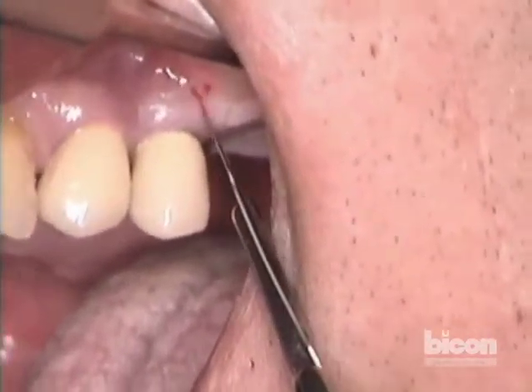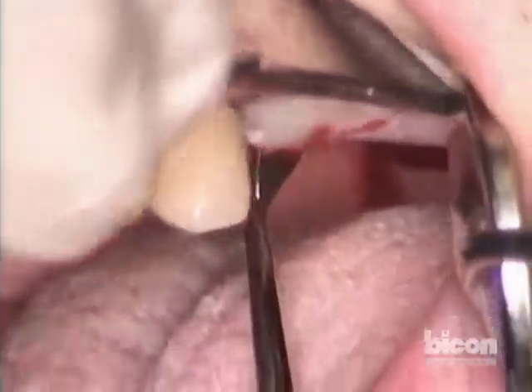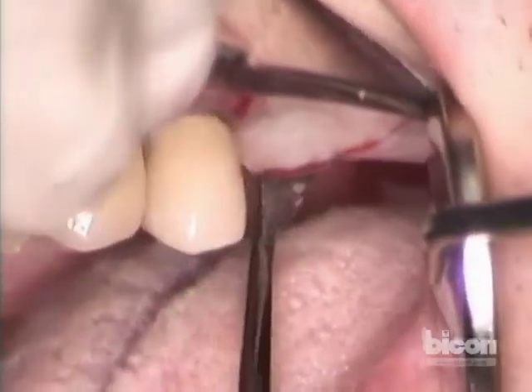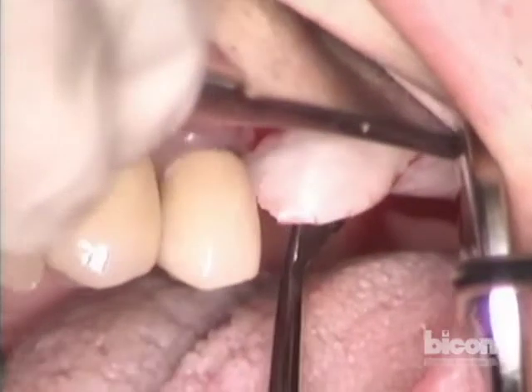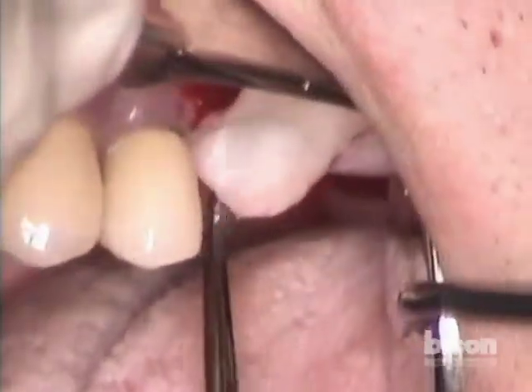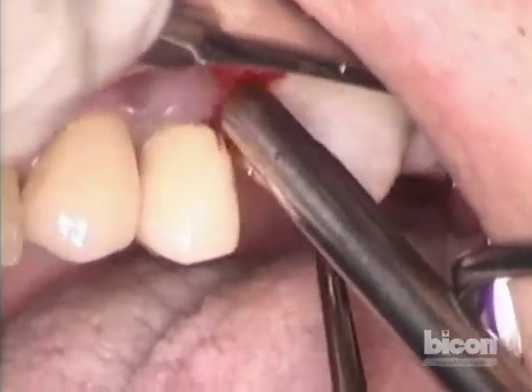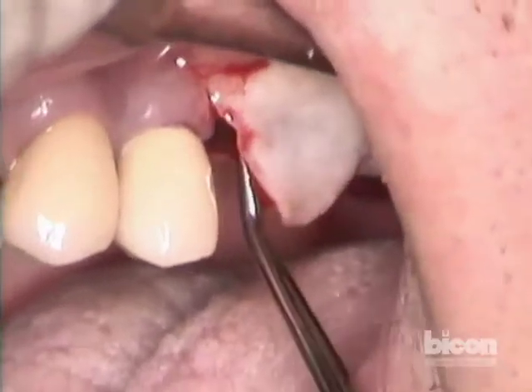Now using a Woodson we will elevate the flap carefully and cautiously until we have full exposure. Before we continue, because we obviously anticipate using a bone graft, we will collect some blood from the site, which is a mixed arteriovenous blood of course.